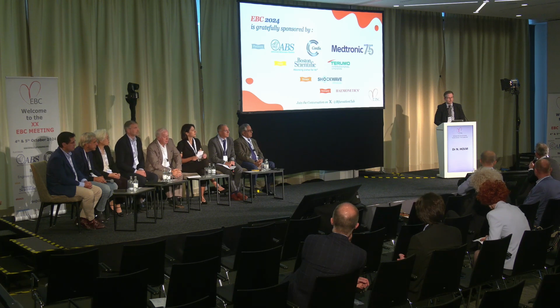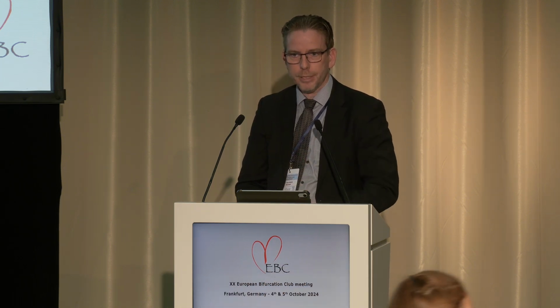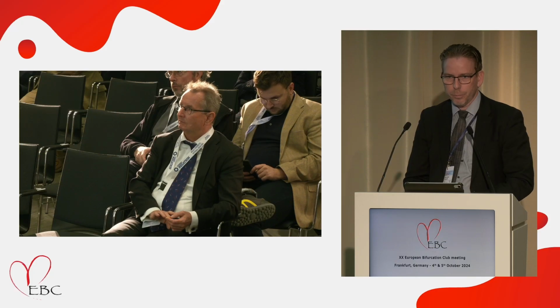How often did you use stent implantation to correct your problem? I don't have those numbers. So it was dealt with in two ways. Some were just post-dilated again, but when it was quite excessive, another stent was implanted in most of those cases. So yeah, but I don't have the numbers for you here.